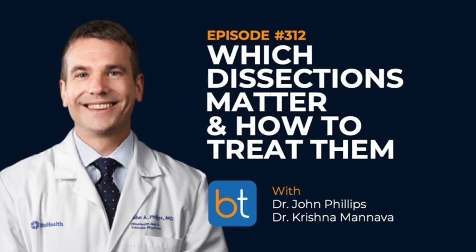Yeah, I think for me, best practice is drug. Our lab was the first lab to deploy the Zilver PTX back in the day, and we were pretty hot and heavy with Zilver for a while. We still use them, but I've gotten smarter about not full metal jacketing these folks. At least in our practice, in the FemPop region, all of our patients get a DCB as a definitive treatment. We're not seeing these folks come back like we used to.